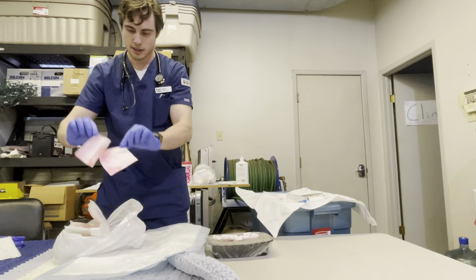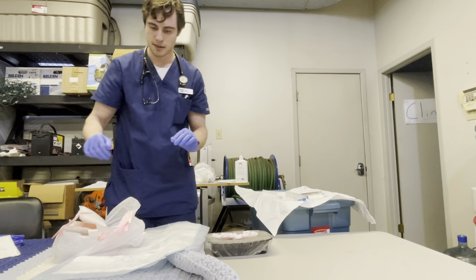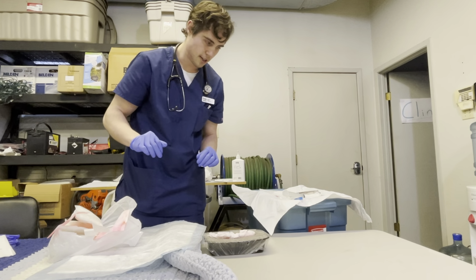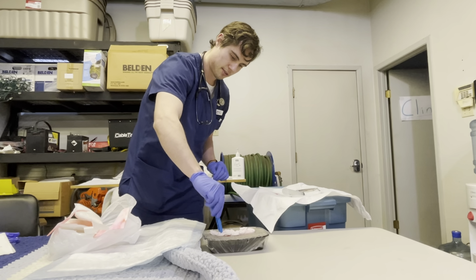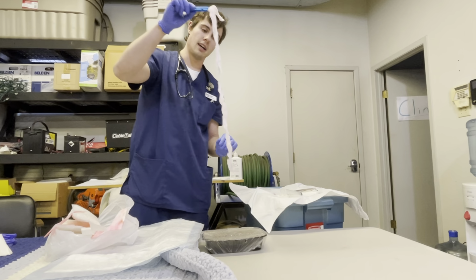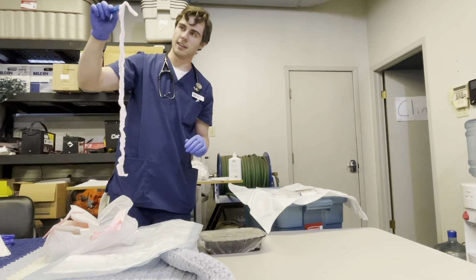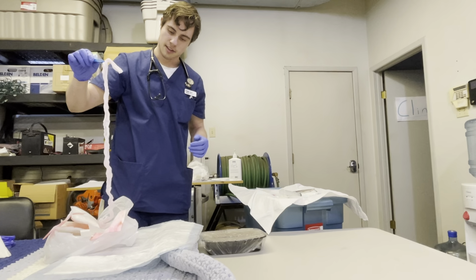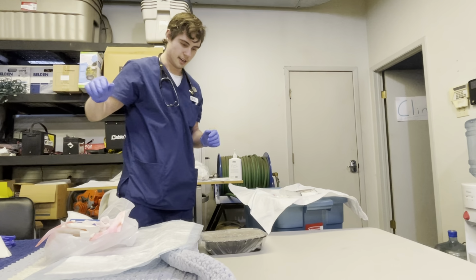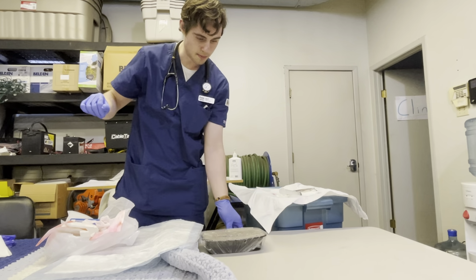Note that we do have a copious amount of serosanguinous fluid with no foul odor. I'm going to take my blue tweezers and pull out the old packing, noting we do have a fully saturated serosanguinous fluid on the packing, and I'll note the length as well, no foul odor. Throw that out. Next, I'm going to measure the wound.